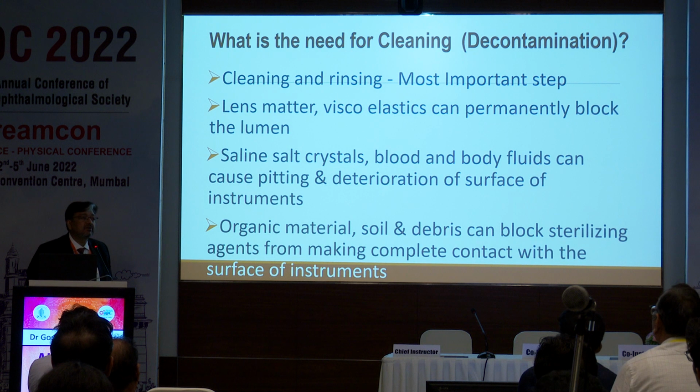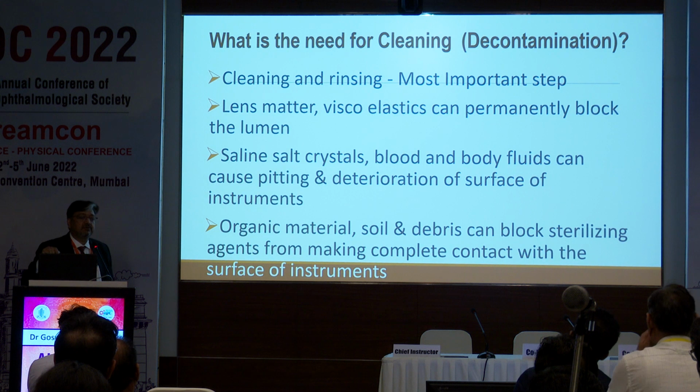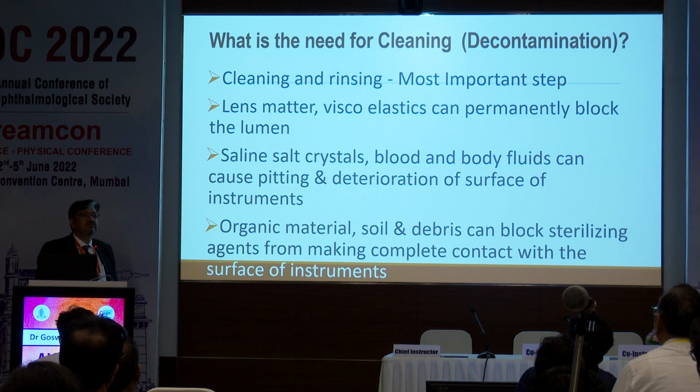So basically, during the autoclaving process, the tissue gets baked in and it goes over the surface of the instrument and doesn't allow the heat or the steam to penetrate and sterilize that area. So when you're about to do the surgery, if that particular baked area or the tissue that is stuck moves away, you're actually operating with an area which is not sterile or not adequately sterile.